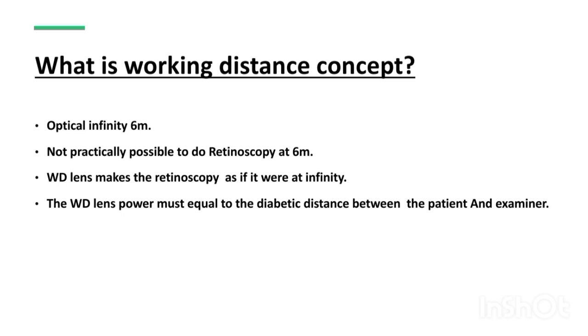So, parallel rays of light are only possible when we send the light from infinity, but it is not possible for any human to sit at infinity and do the retinoscopy, isn't it? So what we usually do is we do the retinoscopy from a finite distance, that is also like one hand distance from the patient.